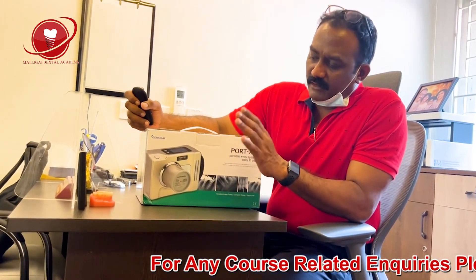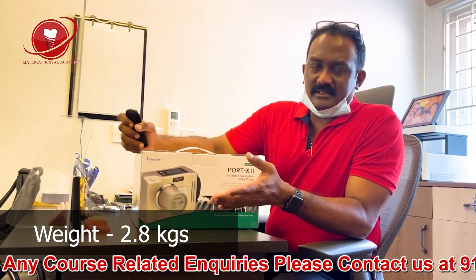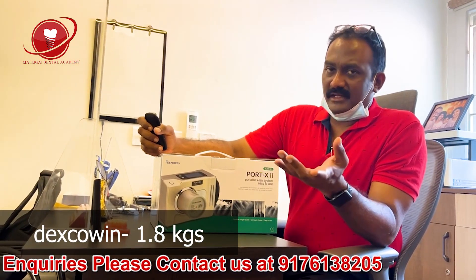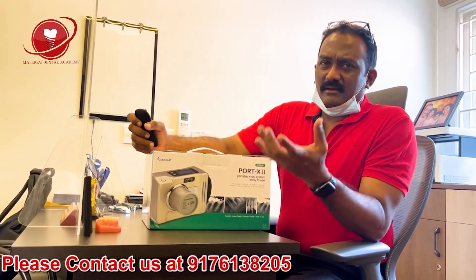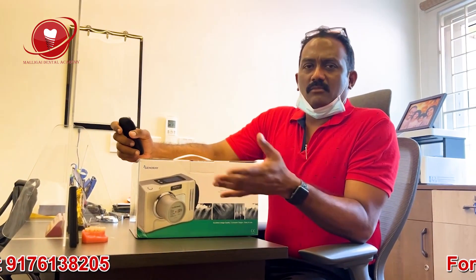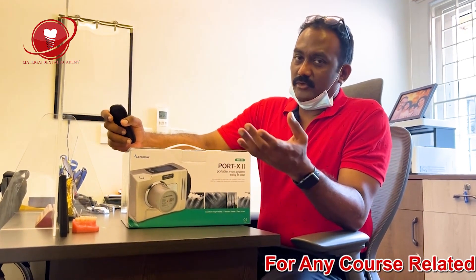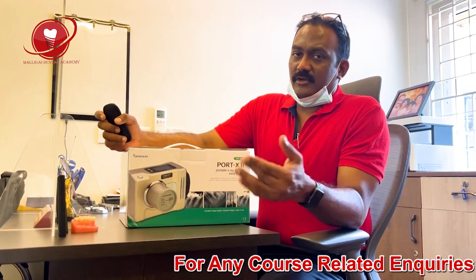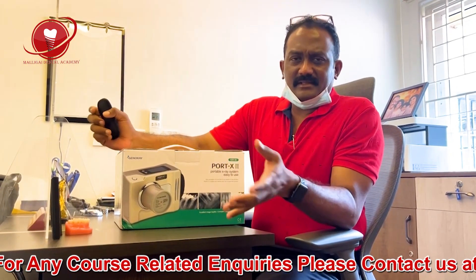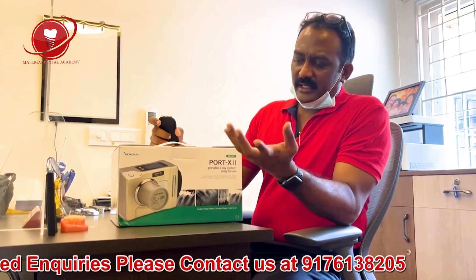Considering the usability of this machine, it's going to be 2.8 kg, which is a little heavy compared to my Dexcowin at just 1.8 kg — the heavier it is, the sturdier it is. In the Indian context, most assistants are women and they need to be really fit to carry this, otherwise they might drop it. But nowadays, since we carry so many handbags, they are getting used to carrying weights, so I don't think it's an issue.